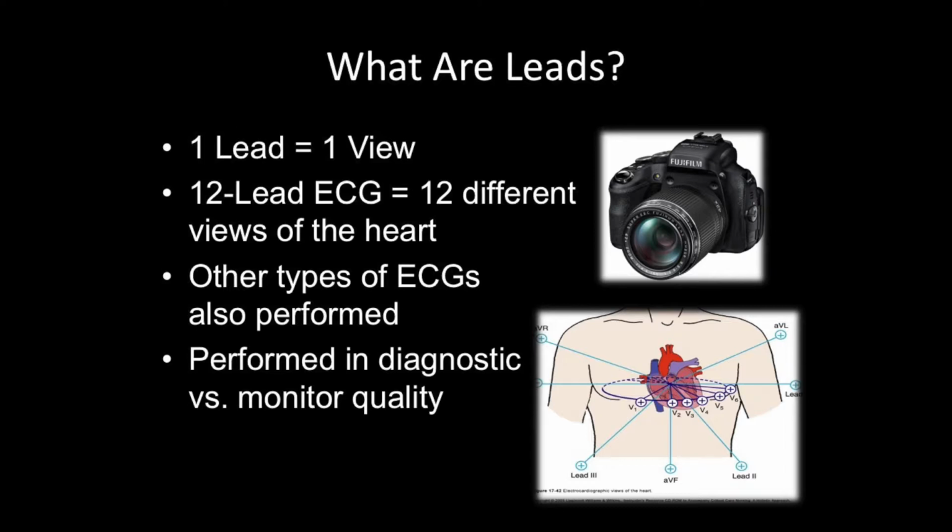And what does diagnostic versus monitor quality mean? If I take 4 leads of that monitor and apply them to you, is that diagnostic level? No, it's a 4-lead EKG, it's not diagnostic level. If I perform a 12-lead EKG, it is considered diagnostic: it's calibrated, everything is measured and set up. So there's a difference between 4 and 12. We want 12. There's also 15 lead, quite frankly, but we'll focus on 12.